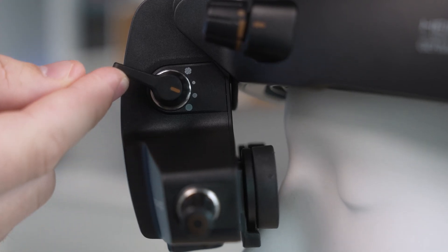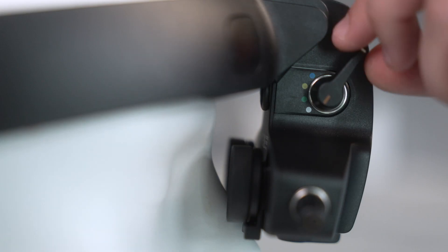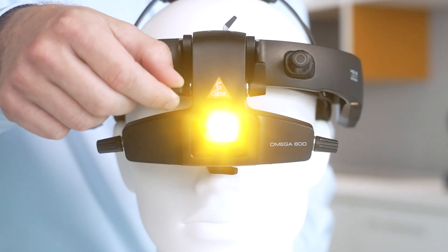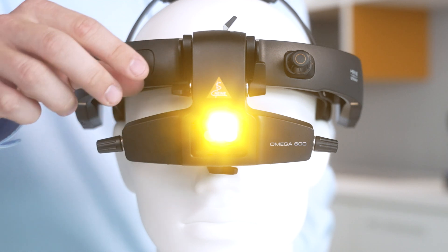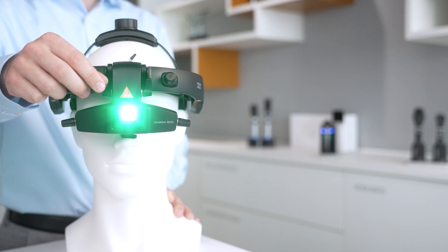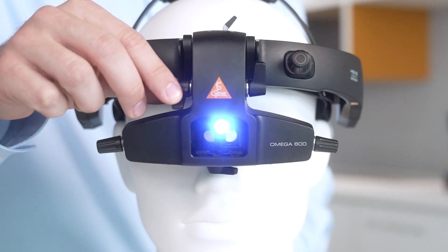Once you're set up, it's helpful to know where each component lives. On the left side of the optical unit, you'll find the aperture selector. You can choose between large, medium, small, and a diffuser option. The diffuser is especially helpful for peripheral exams. On the right side, you'll find the filter dial. This lets you toggle between an unfiltered or yellow filter for general exams and for photophobic or pediatric patients, a red-free or green filter for better contrast in the retinal vasculature, and a cobalt blue filter for use with fluorescein dye to detect corneal damage or foreign bodies.